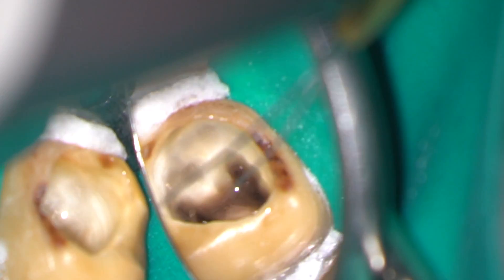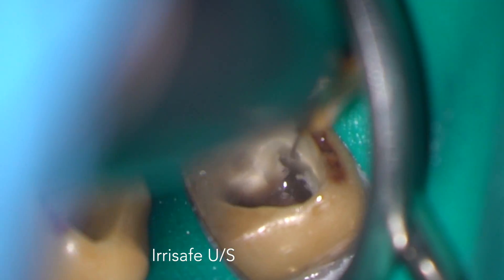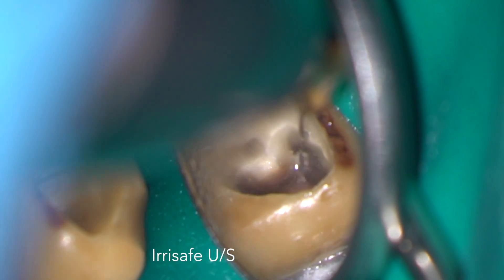In order to break up and remove any remaining bioceramic sealer, I used an Irrisafe ultrasonic tip during the irrigation phase.